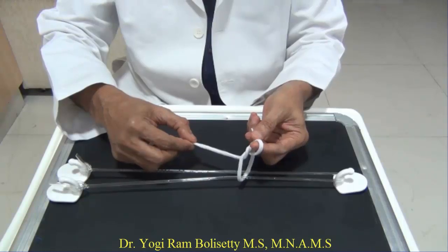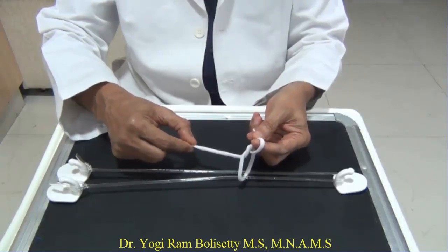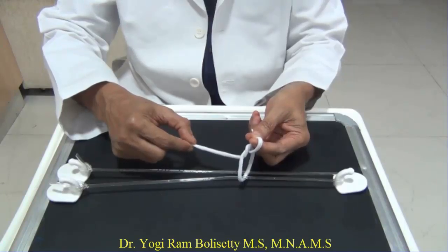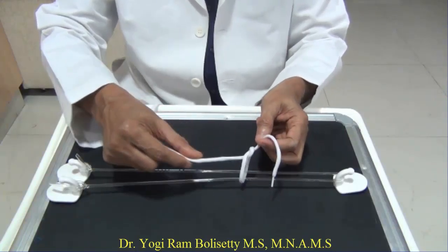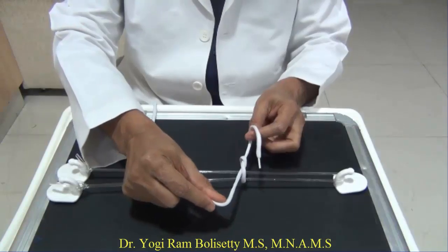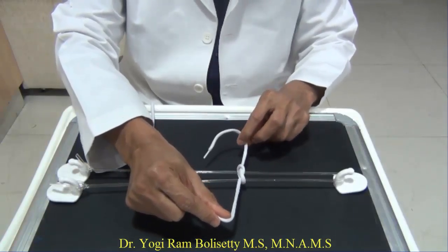Get the thumb close to the index finger. Grasp the short strand between the thumb and the index finger. Leave the middle finger. Now the first throw is formed. Tighten the throw.